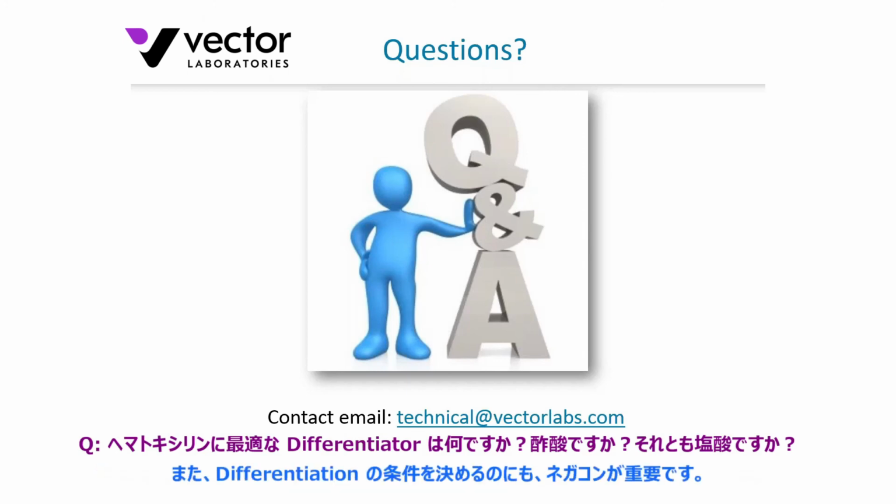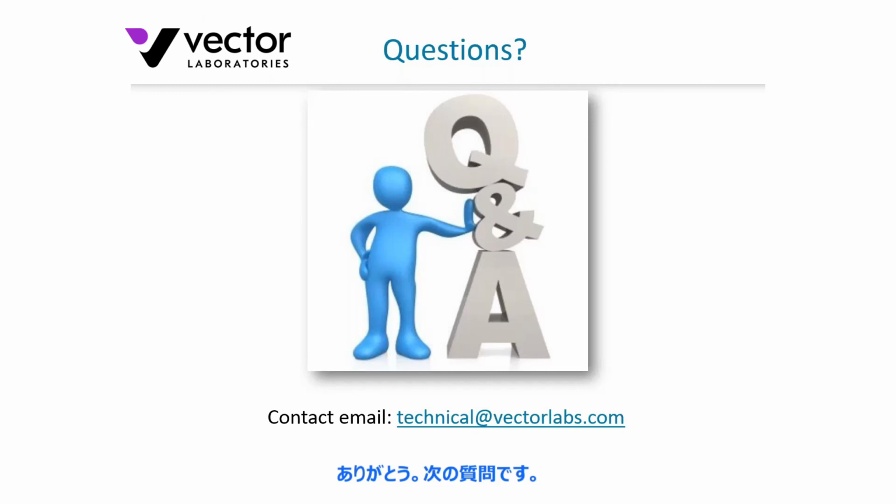And this is where it'd be important to run that negative control section, that test section, just to gauge some of those parameters. Look for consistency. Make sure that you run one or two test sections for each different tissue type and species of tissue that you're working on, just to gauge the intensity that you will find appropriate for that given application. All right, thank you, Craig.